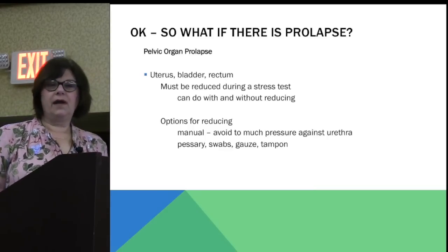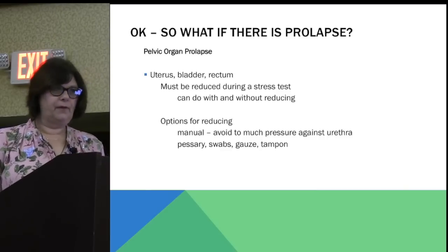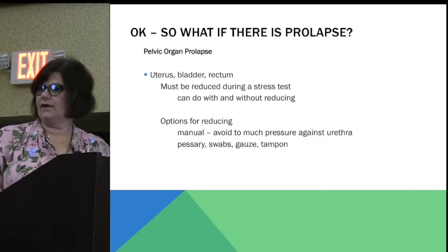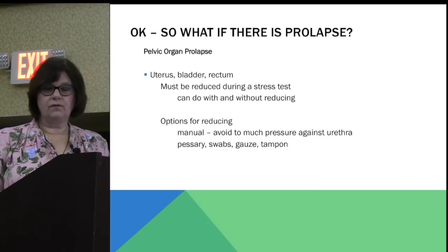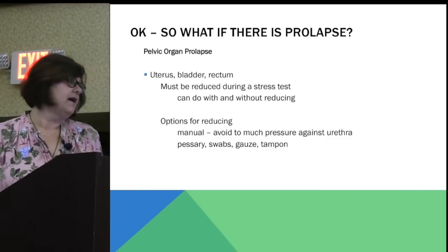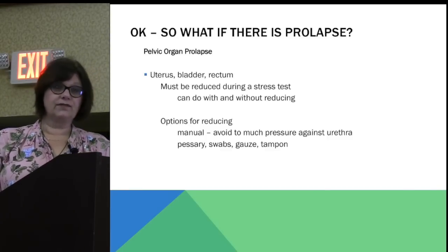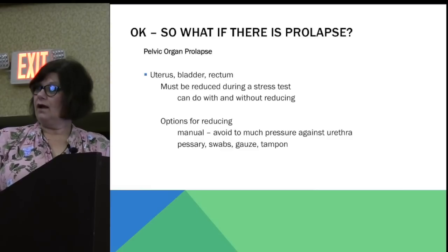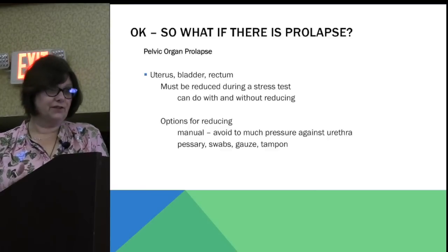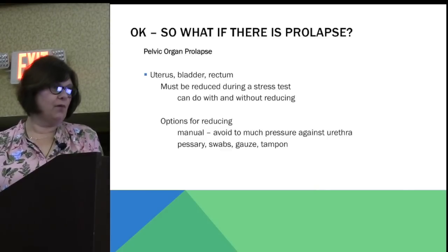Pelvic organ prolapse. So say we've got a female with a big prolapse, and they're going to surgery to have the bladder fixed. They don't complain of incontinence, but one of the reasons we're doing the test is to see, once we fix that bladder and put it back up in place, will they have incontinence? Because with prolapse, the bladder is falling down, and it can often close off the urethra, or act as a natural way to block the urethra from having incontinence, right? Because it's putting pressure on the urethra. It's not allowing the urethra to be wide open.